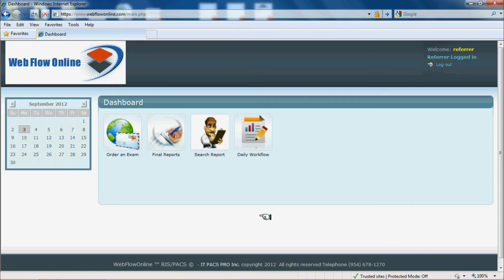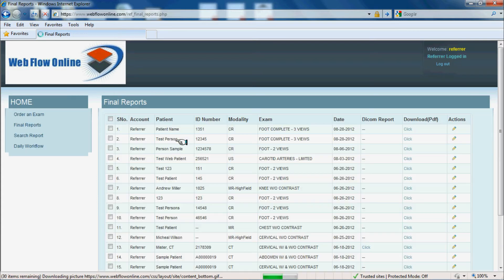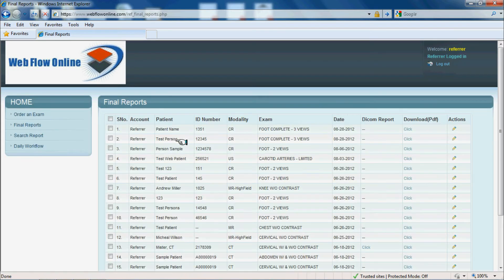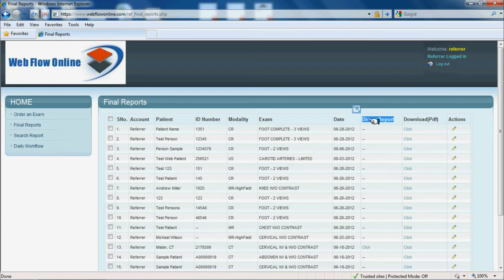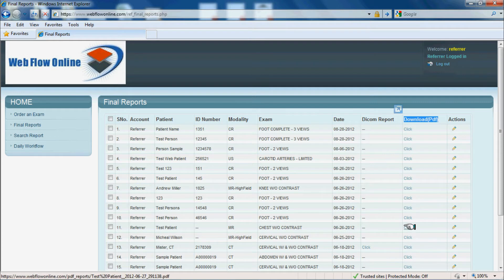This demonstration is for the front-end access for your referring physicians and ordering physicians. They would log in and click on final reports. There is a column for DICOM images and a column for final PDF.